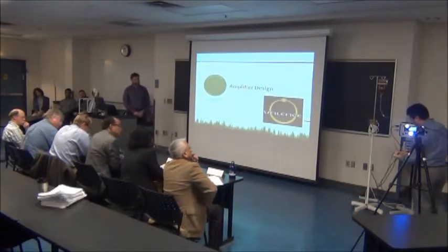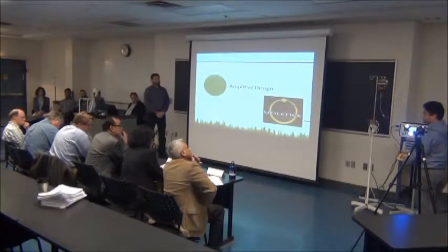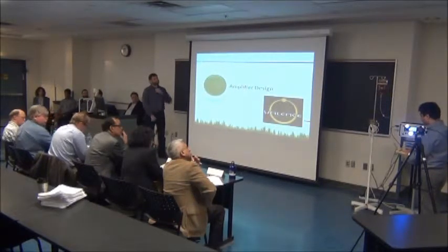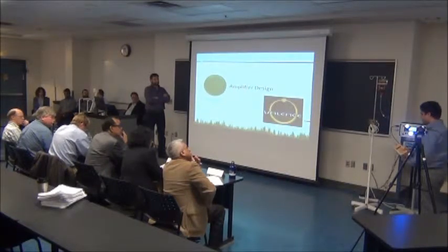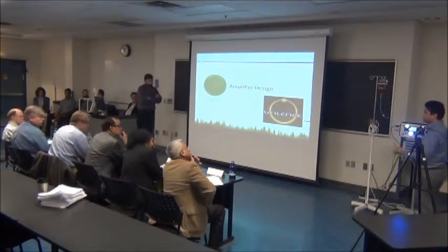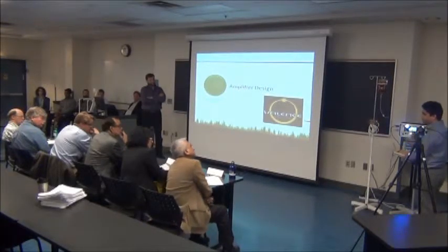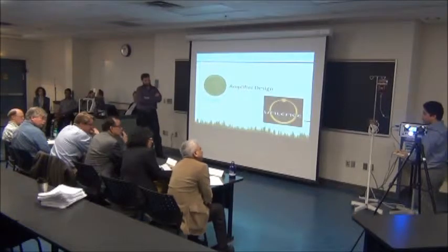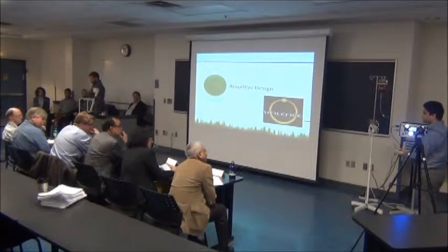Clinically, the nurse connects the machine to the patient with the transducer and the blood pressure cuff on it, and in this case we have a patient simulator. The first procedure the nurse does is zero the pressure signal. First they open the stopcock to the atmospheric pressure, and they zero down that atmospheric pressure to zero.